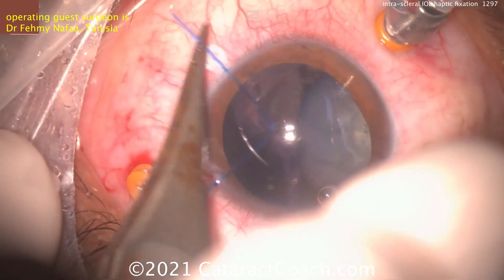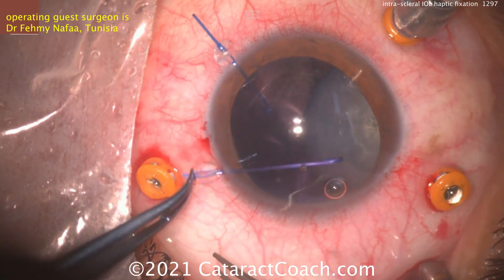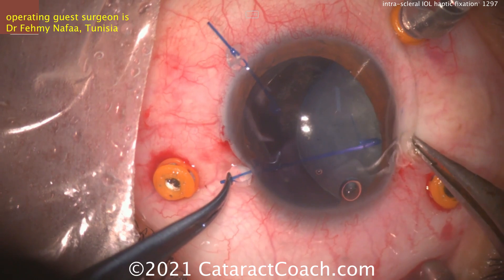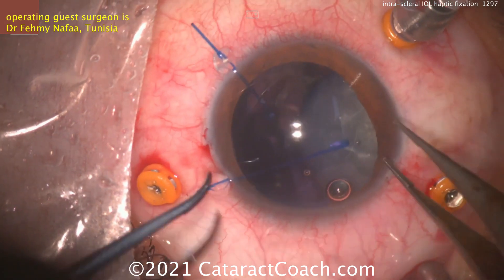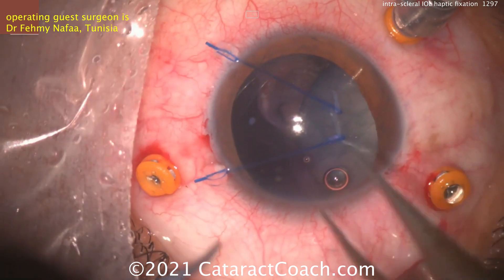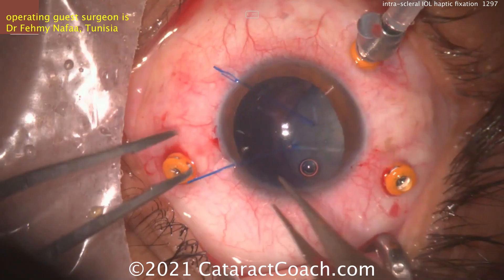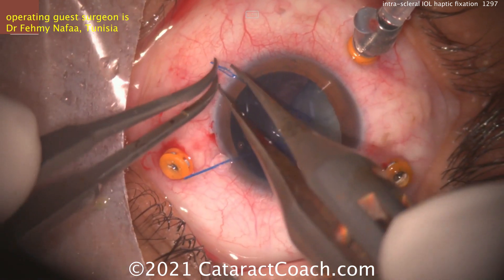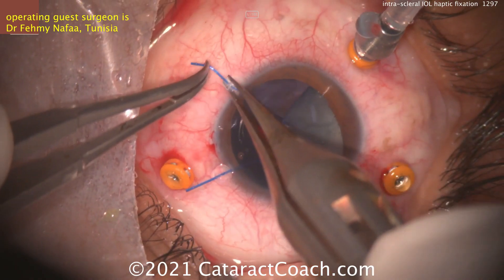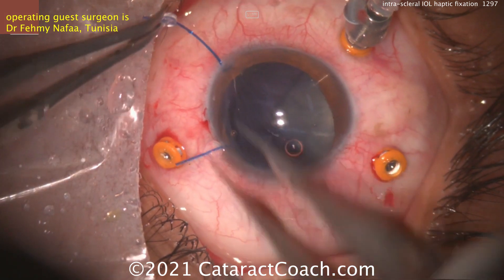Hooks going in — these are iris hooks, which do work to bring that over, but probably a better option are the capsular hooks, which are longer with a smoother end and will get out to the lens equator. While an iris hook is okay, a capsular hook is a better option here. The capsular hooks would go to the equator and you could tighten them up, but with an iris hook it may just poke and damage the capsule more, causing the capsule to rip.